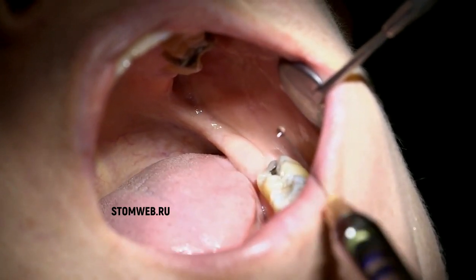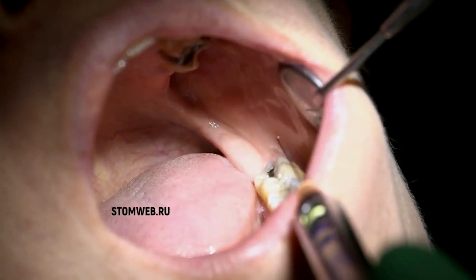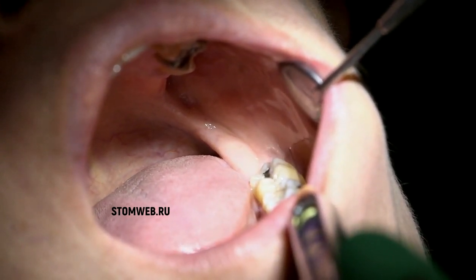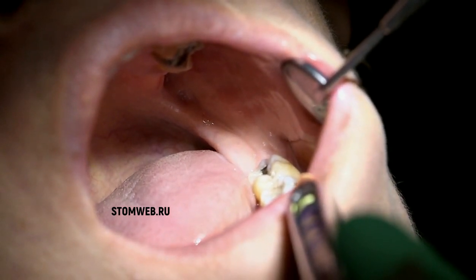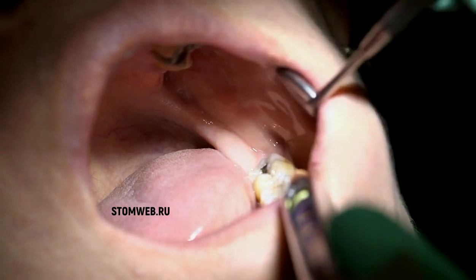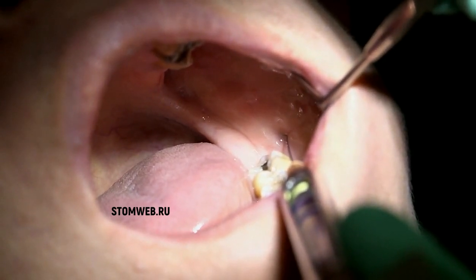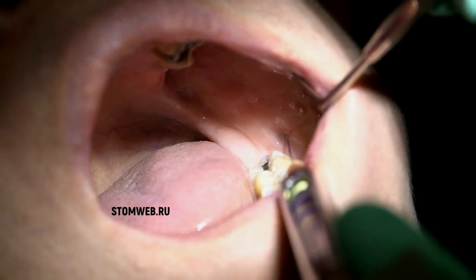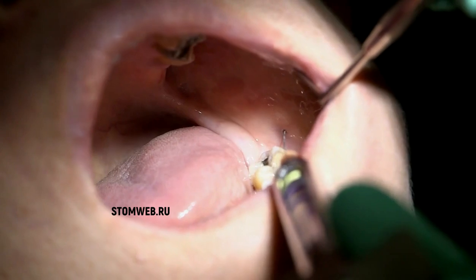Carefully retract the buccal mucosa with the mirror and hold the tissue taut. Orient the syringe so that it is parallel to the occlusal plane on the side of the injection. Insert the needle 2 to 3 millimeters and deposit approximately 0.2 to 0.3 mLs of solution. Withdraw the needle carefully.